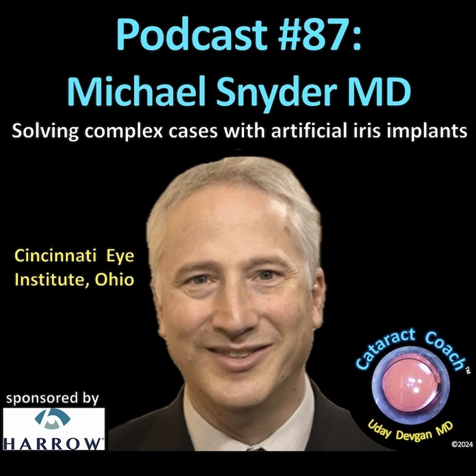But if we just do 2 or 3 throws on these, you can actually pull the suture apart with a little bit of tension. And so that would be really undesirable. If you do a beautiful case and you go to tuck the knot inside and then it unwraps after you tuck it inside, oh, that's snatching defeat from the jaws of victory.